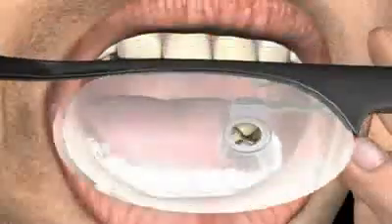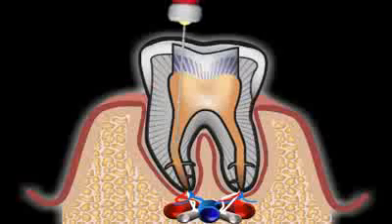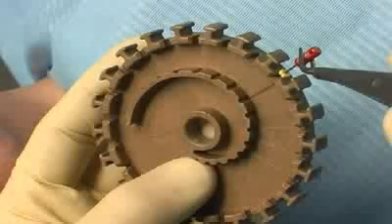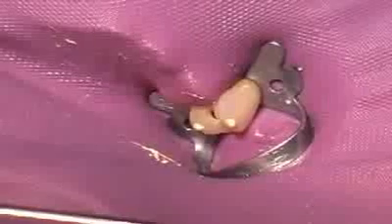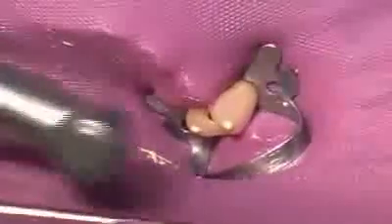The dental canal must be fully reconditioned all the way to the root end. The length of the root is ascertained by means of X-rays and measuring aids, as can be seen in this image. Only a well-reconditioned tooth, filled all the way down to the root end, can be preserved permanently. If the tooth has a strong foul odor, if pain is experienced, or if there is severe bleeding from the interior of the tooth, then a final filling of the tooth's interior should not be done.